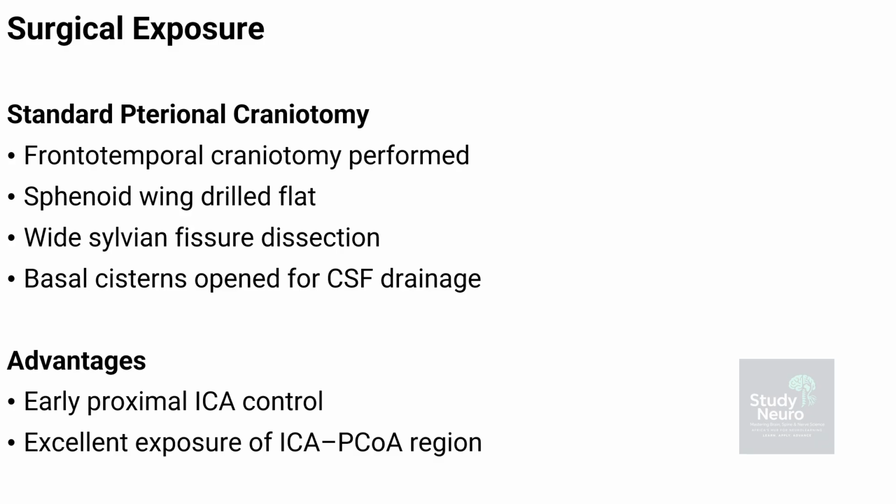This approach allows early control of the proximal internal carotid artery, which is crucial in case of intraoperative rupture, and it also provides excellent exposure of the ICA-PCoA junction, where most aneurysms arise and where precise dissection is required for safe clipping. Control comes first.